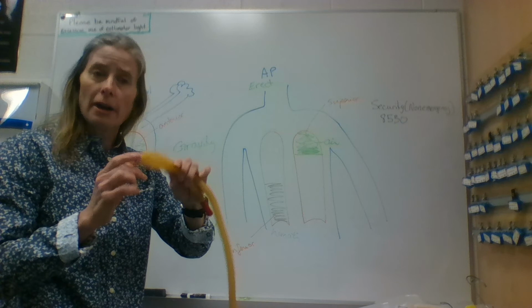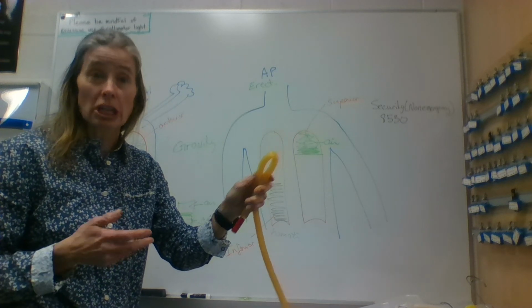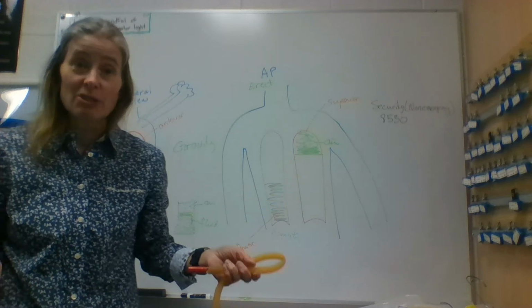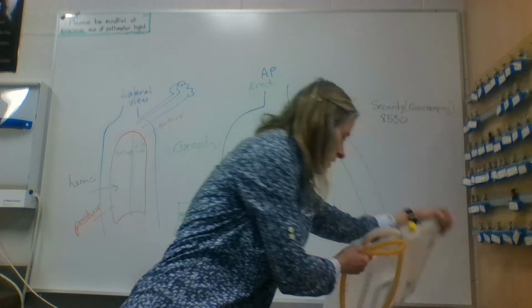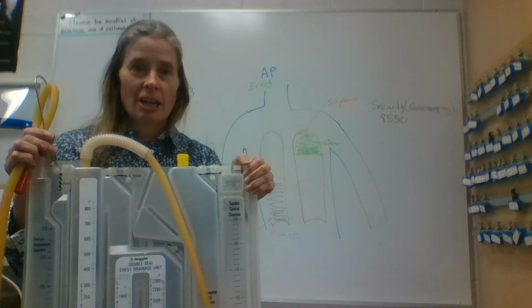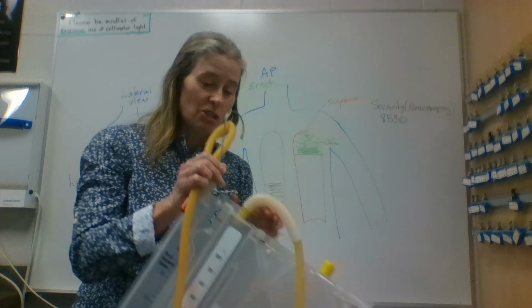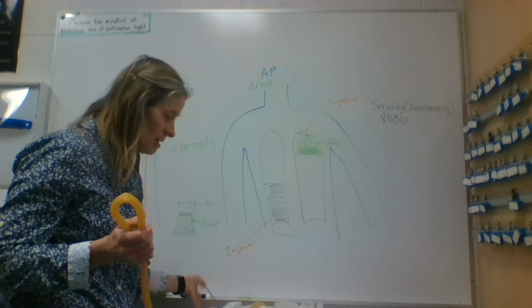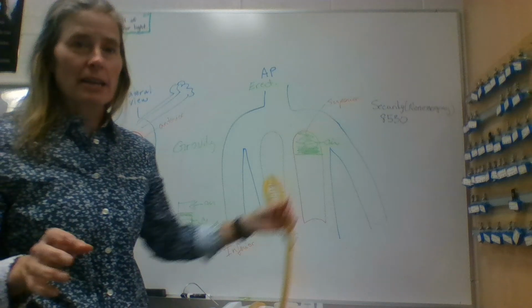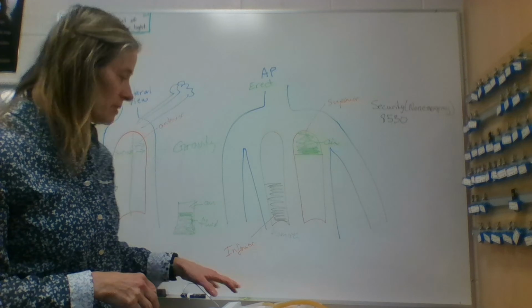You might wonder how that would happen. A wheel of a wheelchair. These patients come down in a wheelchair with this big cumbersome unit hanging off it, and it's very easy for it to get kicked. So please continuously inspect and monitor to make sure these units are in place. It happens when the transfer is occurring.